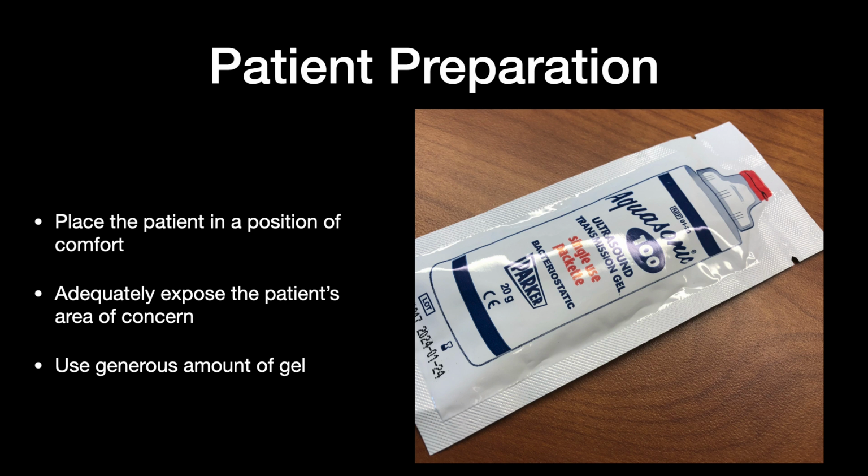Once you and the patient are in the position of comfort, then obviously you need to expose the area of concern. But unfortunately, given the nature of what we're scanning, this is oftentimes going to be decently painful. So we have to find ways of getting the scans that we need, applying the appropriate probe pressure, without causing undue and unnecessary pain. A couple techniques I've found helpful: first, being generous with the gel, right? You can call it whatever you want. I like to call it a standoff pad. If you apply a copious amount of gel to the patient's skin surface, you can almost glide that ultrasound transducer across that pad and not apply a ton of pressure to the skin surface itself, making things a little bit more comfortable, right?